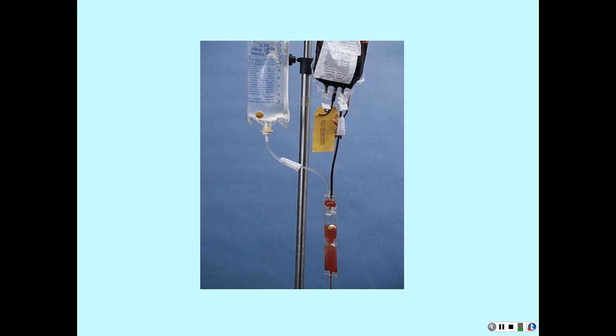Okay, you've got the right patient, the right medical record number, the right date of birth. You've got the right bag number. You've got the right bag type, blood type. Okay? They sign your form, you sign their blood book. And then you, the chart, and the bag of blood go back up to the patient's room.